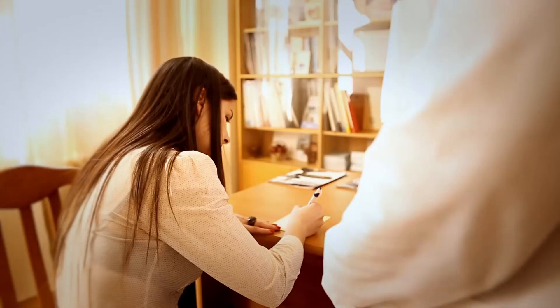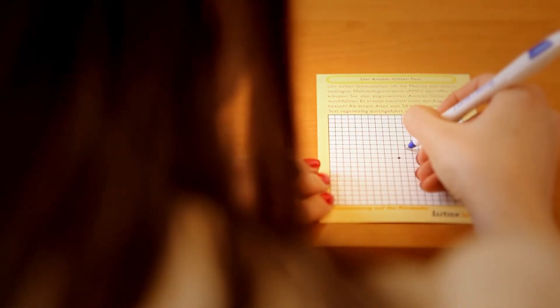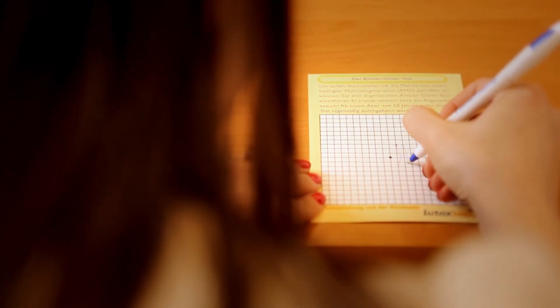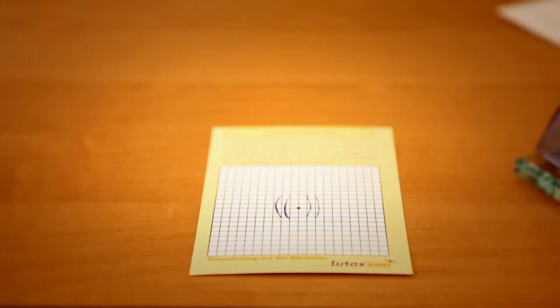The patient should not move the gaze from the center dot so that the presence of any distortion can be assessed. If visual disturbances are noted, the patient is a likely candidate for further studies. Reduced visual acuity is the best single criteria by which to differentiate potentially blinding conditions from less serious ocular disorders.